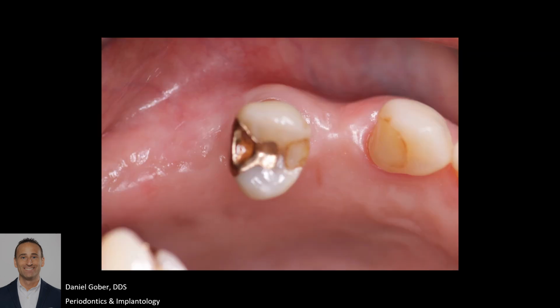It's more obvious when you look at it from an occlusal view. Here we've illustrated our buccal contour deficiency with our yellow line. Our blue line is telling us where it would be ideally, and we have to go ahead and perform a procedure to regenerate the area that's missing.